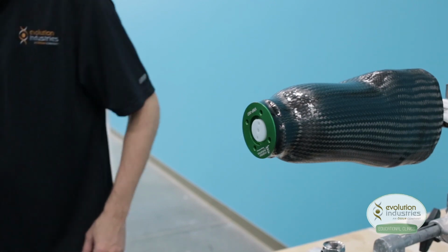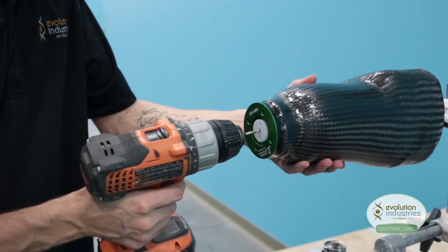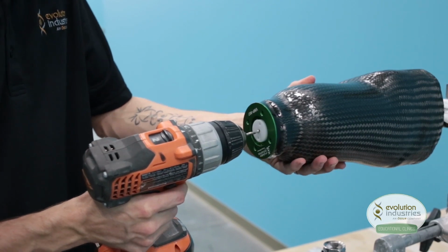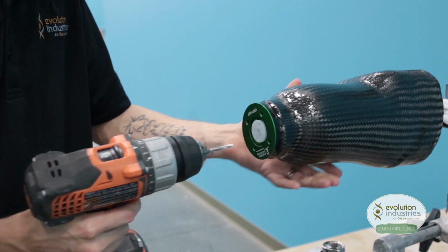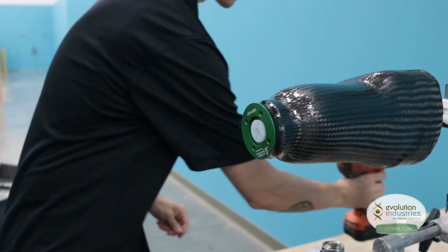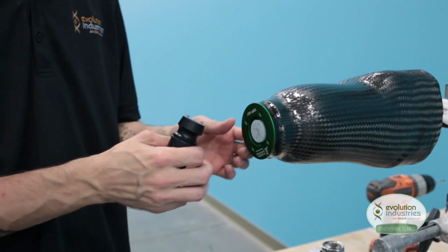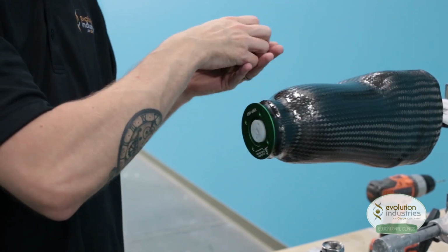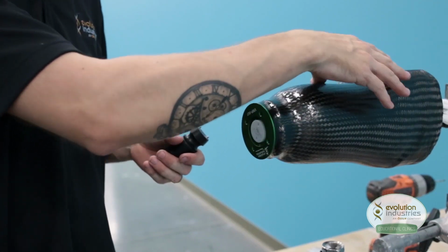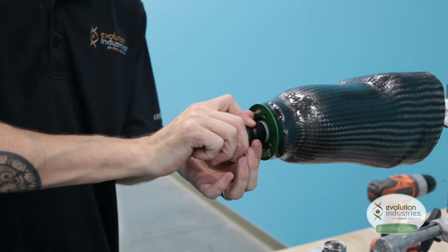And you want to use your drill with the 1/8 inch bit, go through the center hole and drill until you hit the plaster. Then you can cut your socket off, trim and smooth it up. Remove the valve dummy.